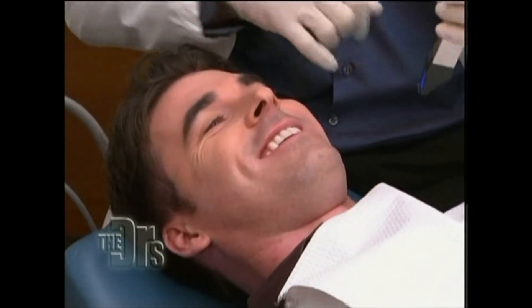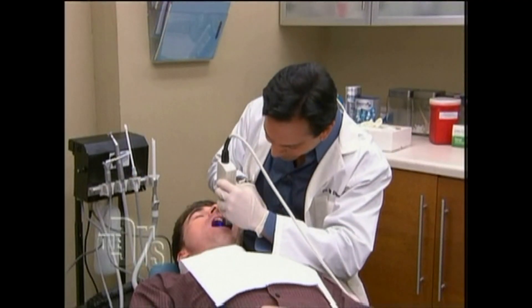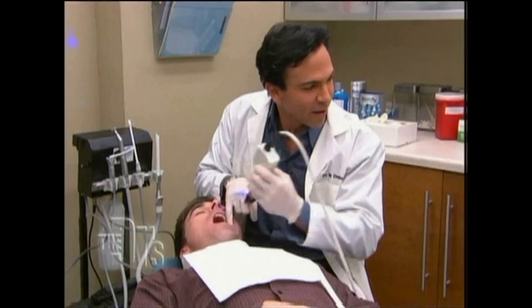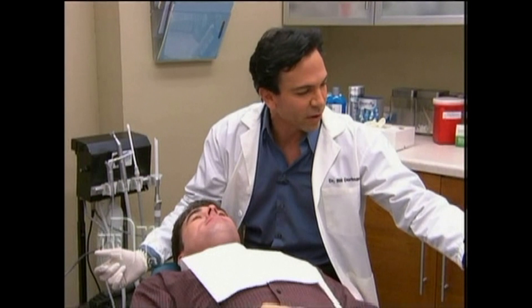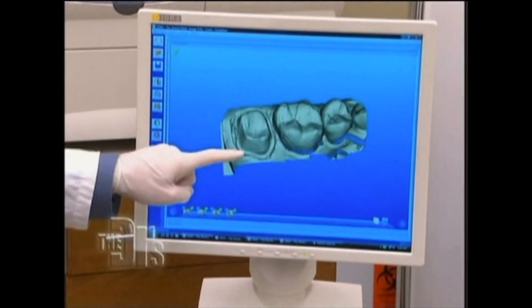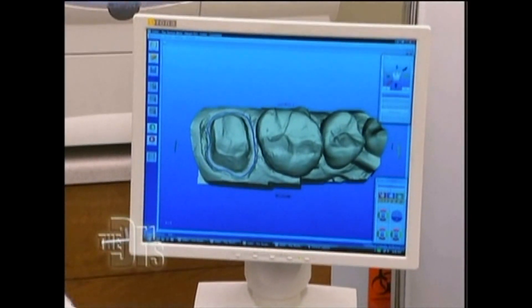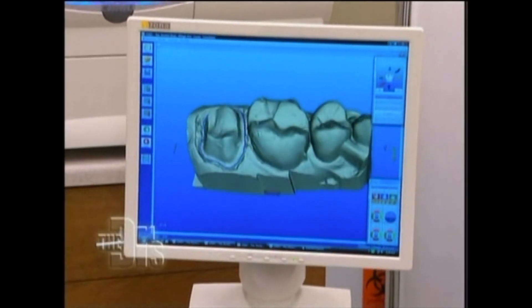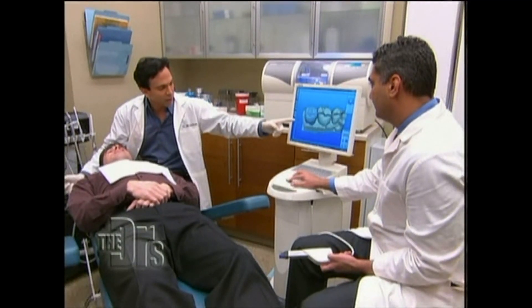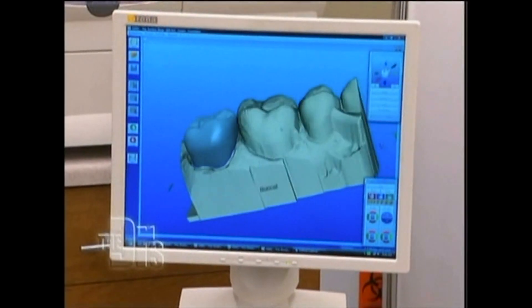Kevin, are you ready? He's ready — he can't talk, he's all numb. Here's what we're going to do: we're going to put this right in his mouth and take this impression. Now, this is a digital impression, and you can see that we can move this around. The impression is going to have a margin — let's show him the margin. This is where the crown fits. At the end, the crown is actually going to go on the tooth, and there's the final crown.